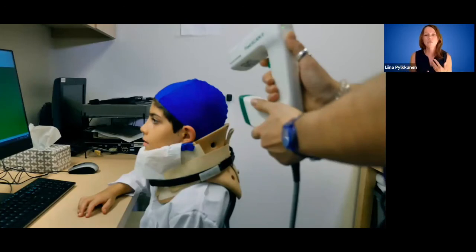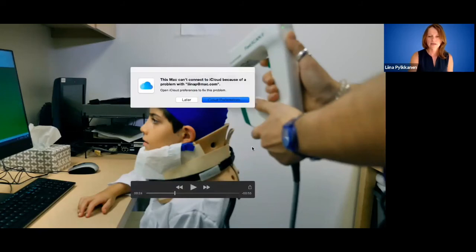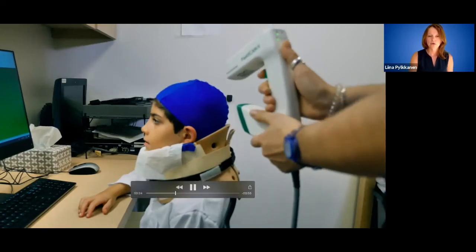That may not always be possible, and so for that reason, we also take a 3D scan of your head, and then when we have that information, we're able to place an average brain inside that volume, and it works pretty well that way as well. We also digitize certain points next to your ears and on your forehead as part of this procedure, and I'll explain to you why that is in a sec.